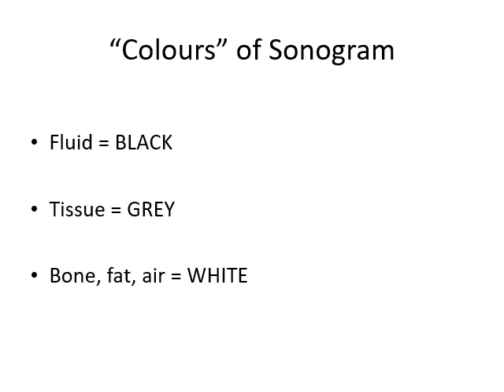So bone, that's kind of nice. That's the same as our X-rays, but fat and air come up as white. Where air would come up as black in an X-ray, and fat would come up as kind of grayish, in ultrasound, they come up as white.